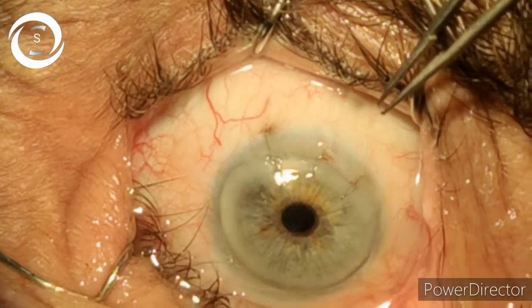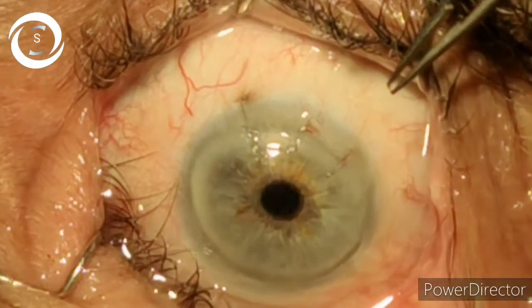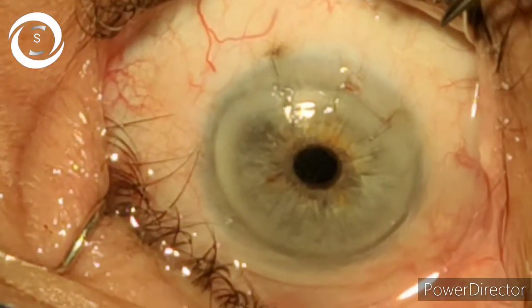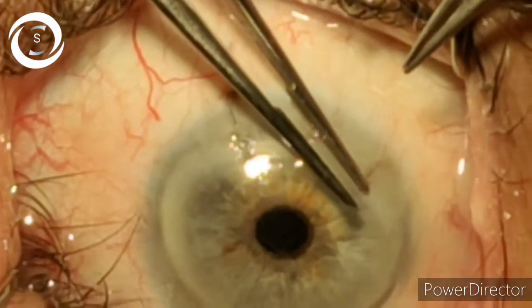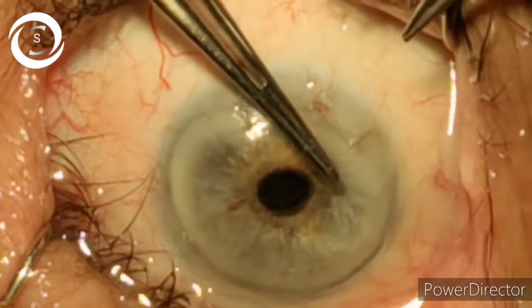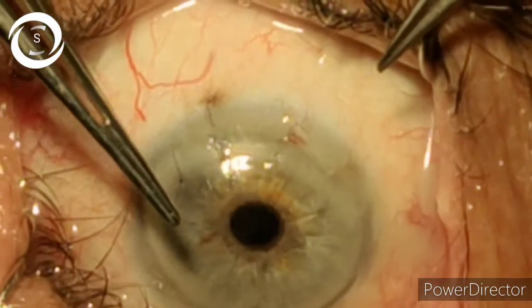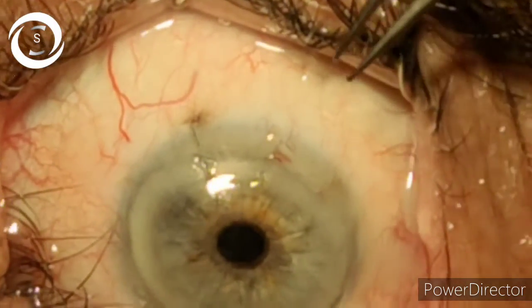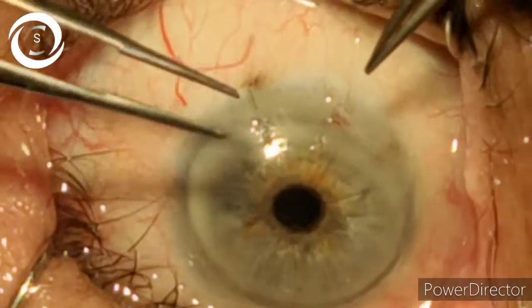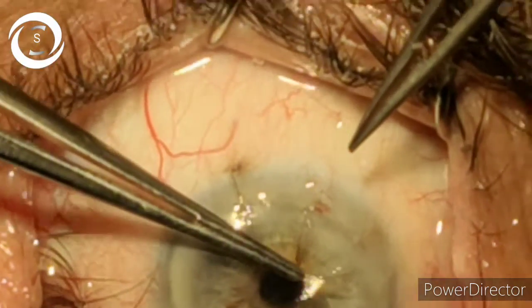With the help of a suture tyer or McPherson or any plain forcep, hold the corneal end of the cut suture and drag it along the surface of the cornea — parallel to the cornea, not in the air. We have removed one, and now for the second one, hold it and gently slide it over the cornea.